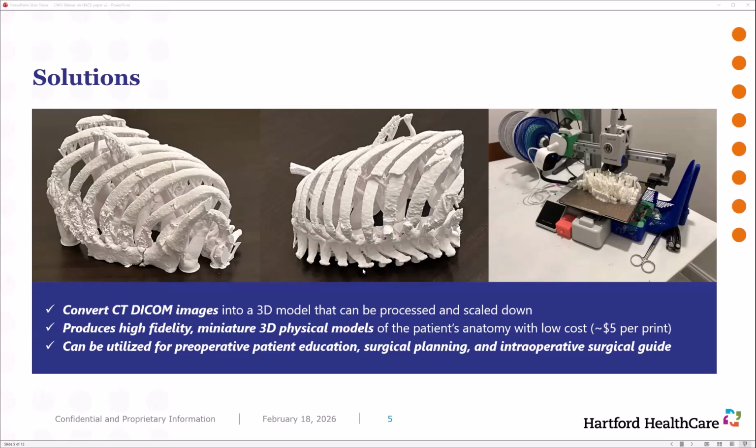And they initially reconstructed the rib, but then they did exactly as you said, Dr. Edwards. They took the other rib, mirror imaged it, found that it was a good fit, and they printed that rib for me, that single rib, and I shaped the plate. And you asked how much time it saved. It was because of the gap and then the quality of the bone. I wanted to make sure I secured the plate significantly anterior.